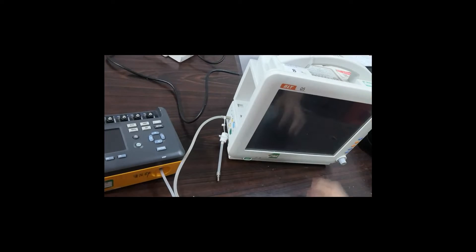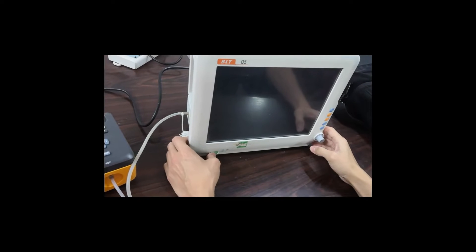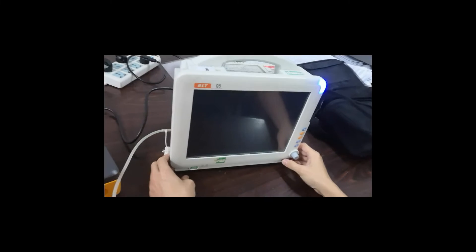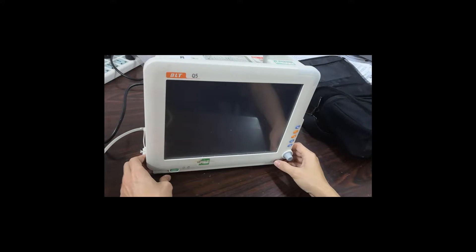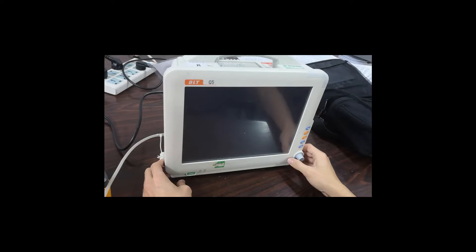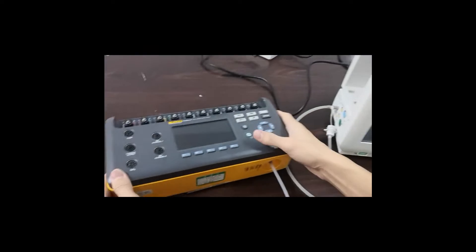Now we start the patient monitor first. Then we can start the simulator.